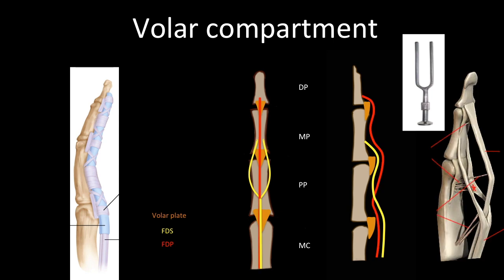The third structure is the flexor digitorum profundus tendon. FDS is superficial to FDP up to the base of the proximal phalanx. After that, the FDS divides into two tendon slips, forming a loop or gap, and the FDP passes through this loop and becomes superficial to FDS. The FDP then runs all the way to attach to the base of the distal phalanx. A key mnemonic: S for S — the Superficial tendon Splits and attaches to the middle phalanx, while the Profundus runs in the midline and attaches to the distal phalanx.